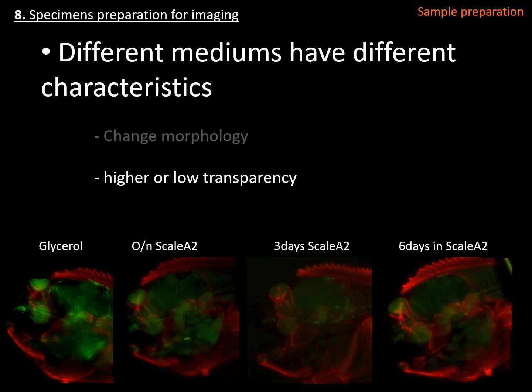Glycerol increases the transparency of your sample quite a lot, but not as much as we desire, especially in these thick samples of 1 millimeter thick.